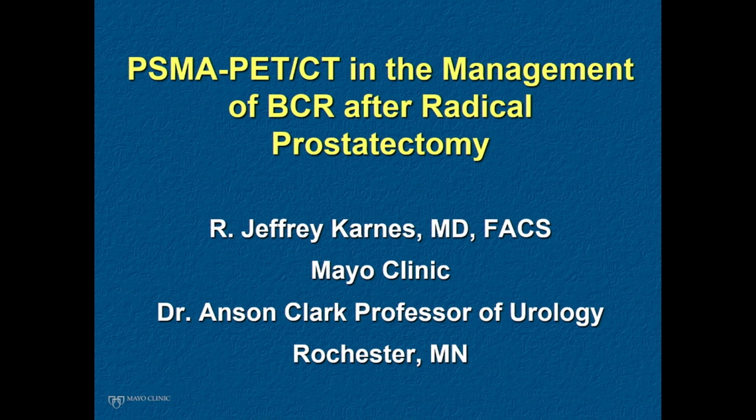Yeah, that's a good one, because I feel like it comes up a lot. So I actually start this conversation with my patients prior to ordering PSMA PET to tell them, look, we don't have really great data one way or the other. This is a new technology. If something comes up that's outside of this localized area, that is maybe a solitary lesion, then we're going to have a conversation about what next to do, because we don't clearly know what else to do.